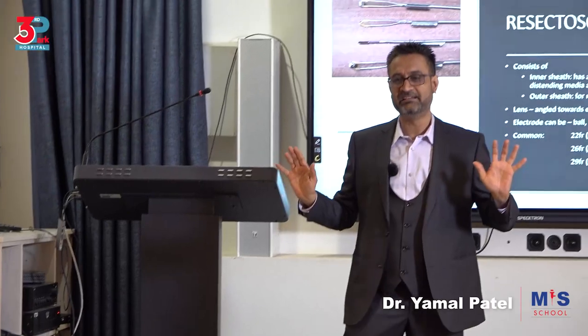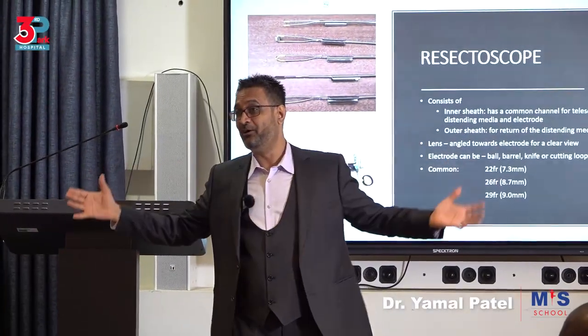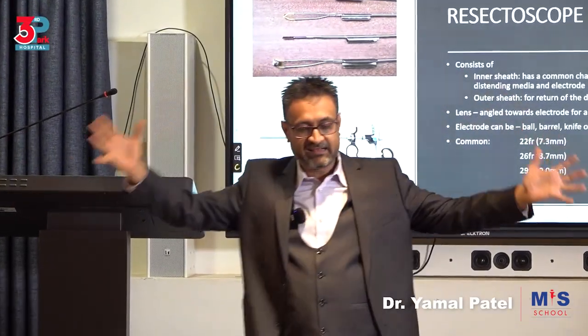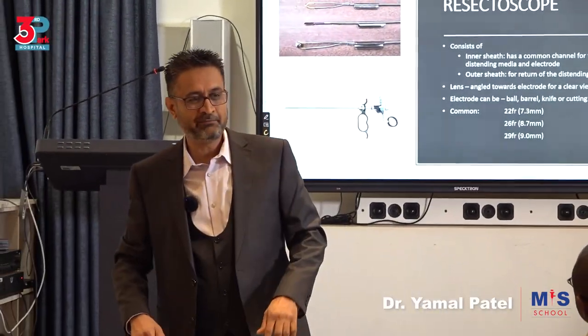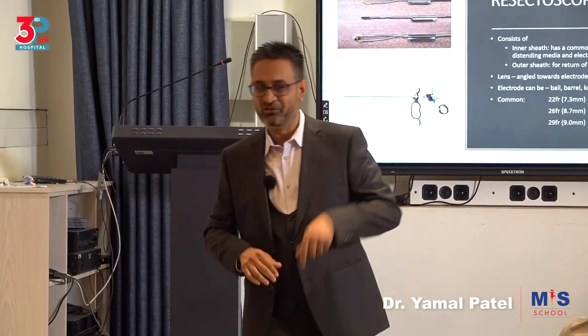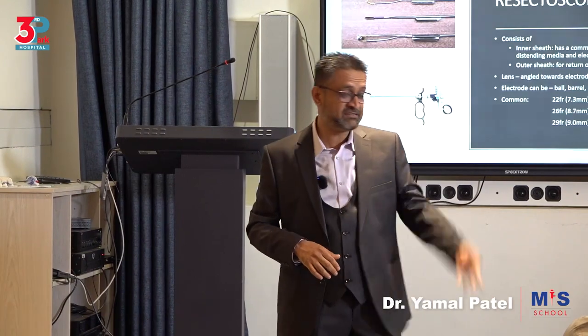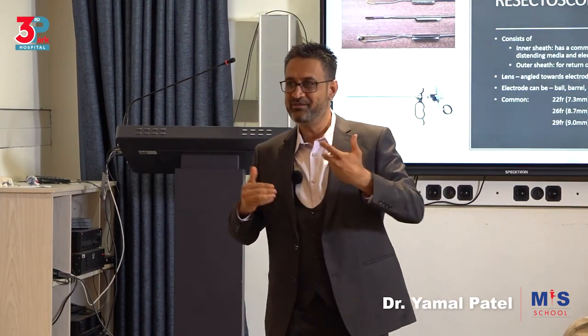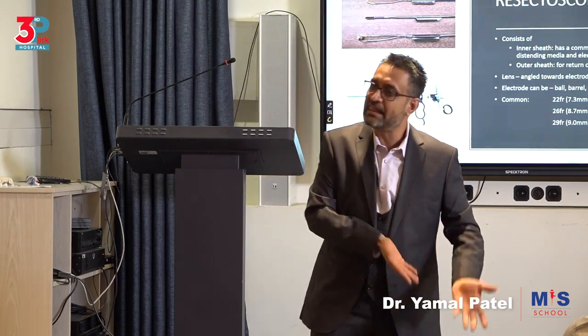So the moment you activate it, the electricity disperses. And it disperses along the whole surface of the uterus and the vagina and wherever the saline is touching. So it's broad out. You've understood? It will disperse into that broad saline curtain around it. So what will happen? Nothing will happen. It will never work. You've understood? So you can increase as much as you want. It will not be working. You'll think the machine is spoiled, but it's actually because you're using a monopolar in saline.